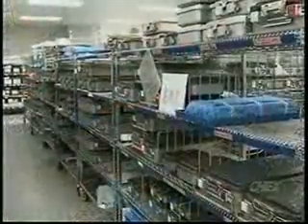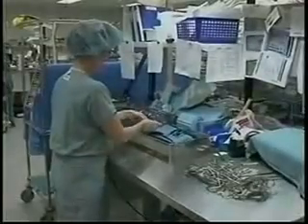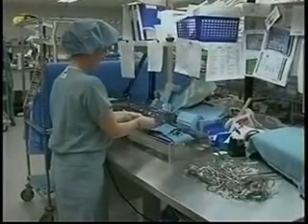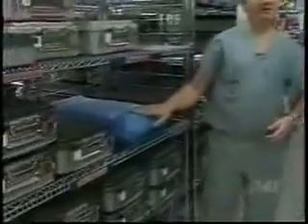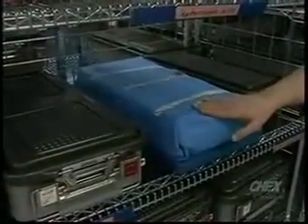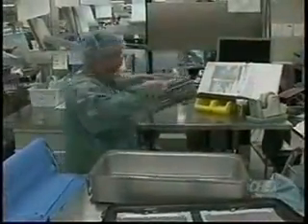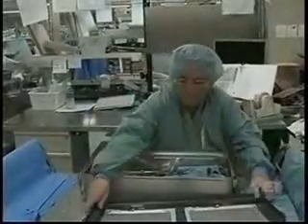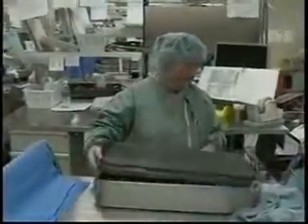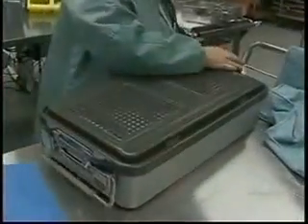Okay, and I understand you've had some reductions in waste here. How have you done that? Yes, we have. What we were using before is these blue polypropylene wraps, approximately 34,000 in 07. We've replaced them with these Genesis containers. They're aluminum containers. And what that has done for the hospital is a total waste reduction of 75% when we moved from the wrappers to the containers. And less waste to the landfill.